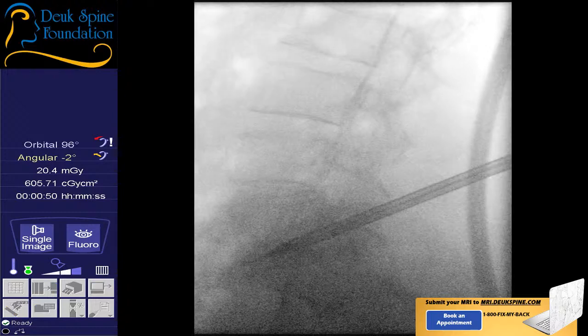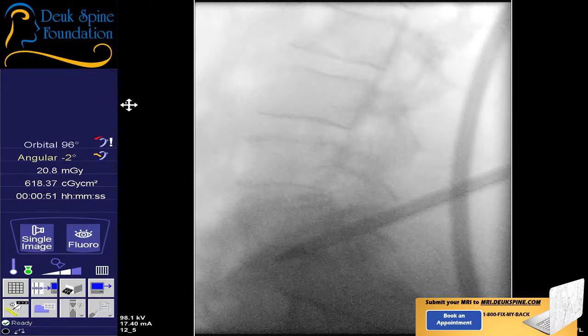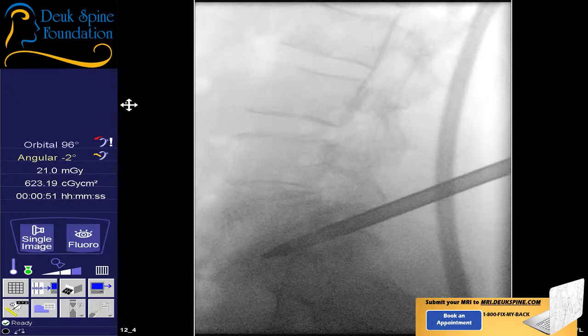Shot. All right. That's got to be good. Good. We weren't trapped too much. Shot. I think that looks fine. It's just the reason why we're not getting a great picture, folks, mostly is soft tissue issues. The more soft tissue that is present between the fluoro emitter and receiving panel, the less quality, less resolution you're going to see.